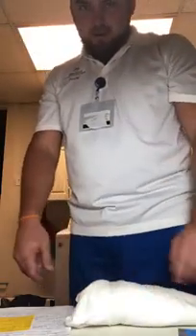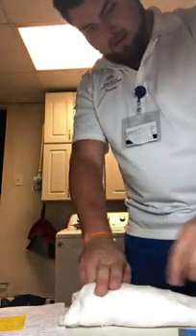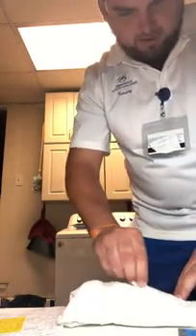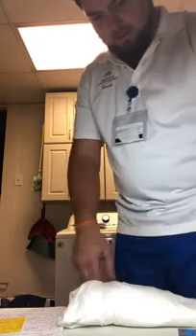So we just have to work with the shirt here. This is her arm. The patient is sat up. We're going to pull the sleeve up. We're going to locate the acromion process with 2 fingers down, and we've got this area right here. So I'm going to get the alcohol swab. I'm going to cleanse the area starting in the middle and working out. I'm going to let it air dry. I'm not going to blow on it or anything.